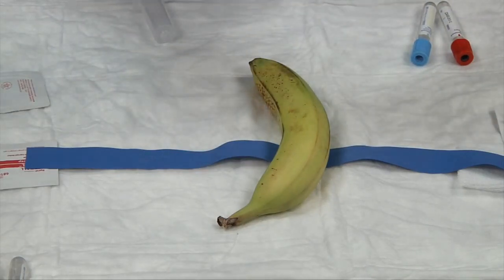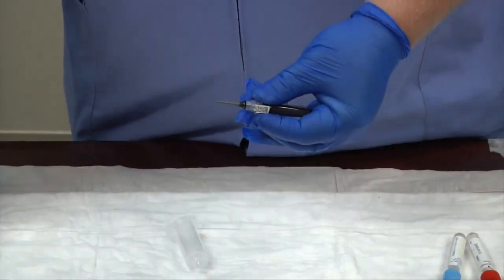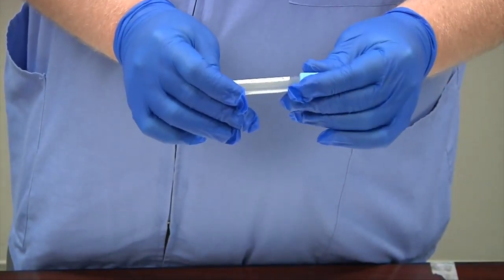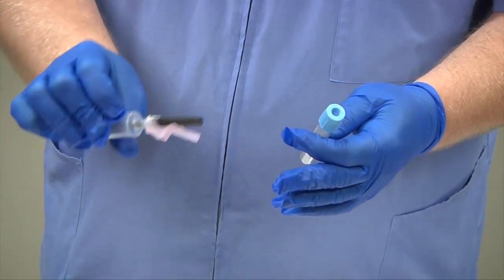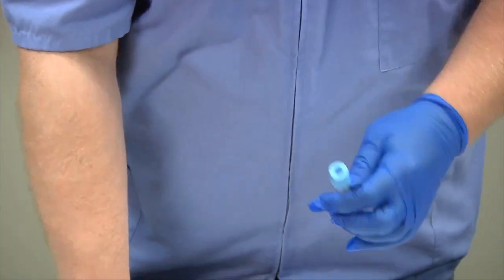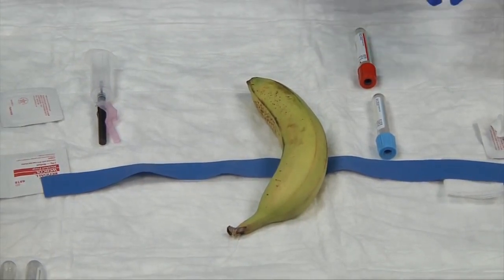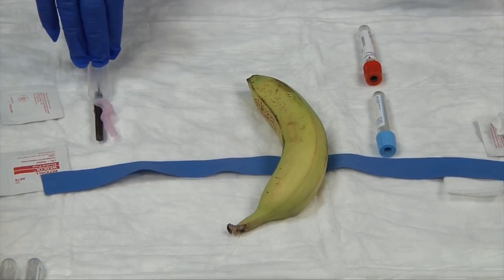As that alcohol swab is drying, I'm going to assemble my needle, checking to make sure it's still in date — it is — and the seal was intact. I tear off the end of the multi-sample needle, insert it into my holder, and tighten carefully. I'm also checking that my tubes are in date. Needles can expire — their sterility can expire — so check the label on the needle to make sure the paper sticker is intact. Expired tubes lose their vacuum suction, and expired needles no longer guarantee sterility.